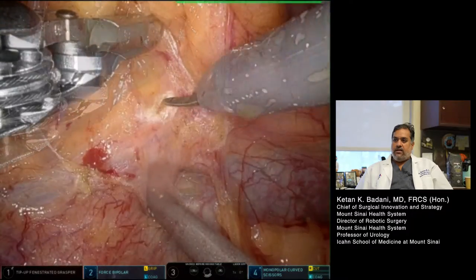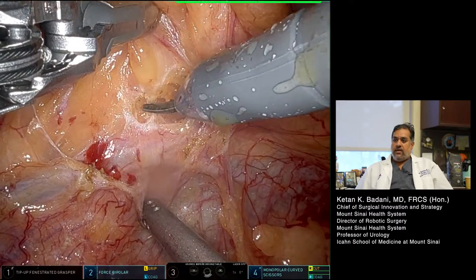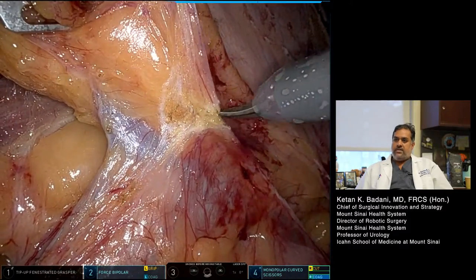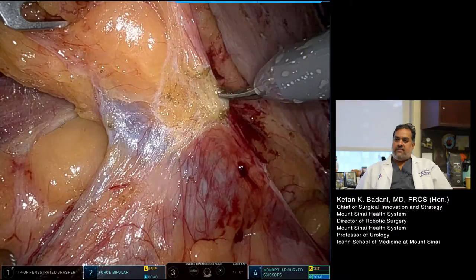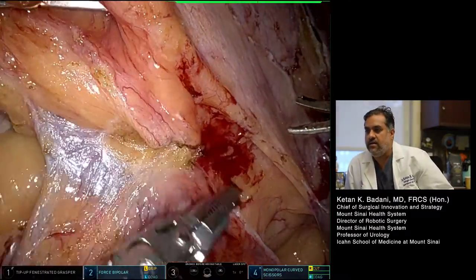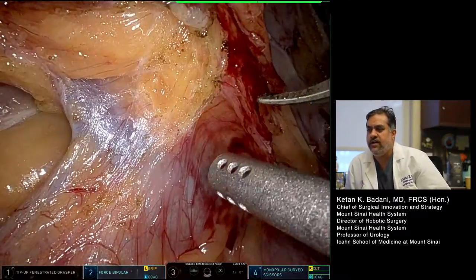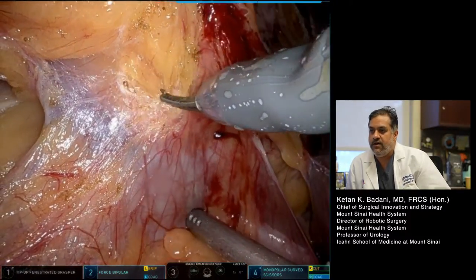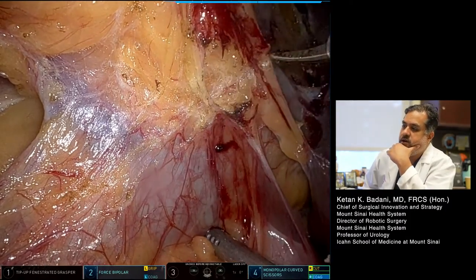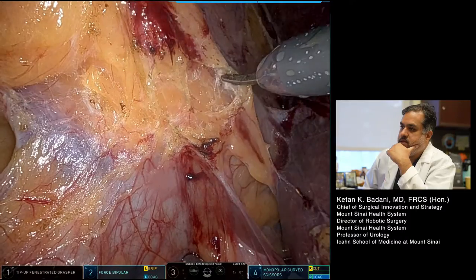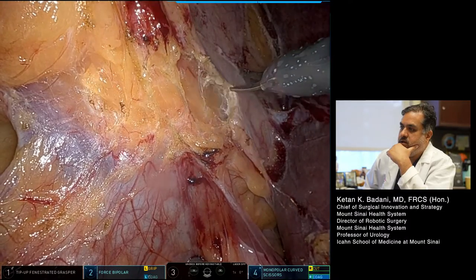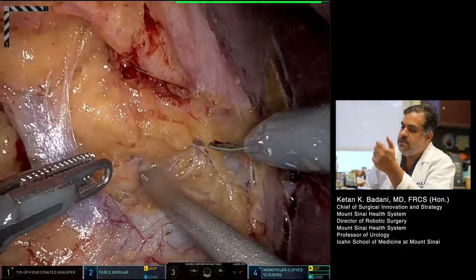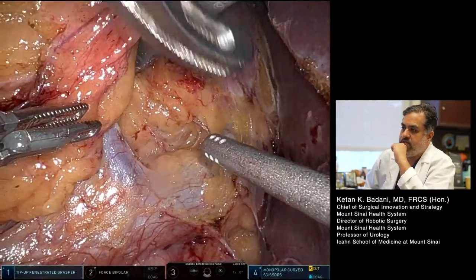Now we have the gonadal vein. The ureter was just seen. On the right side you'll see the anterior surface of the vena cava. I'll incise the retroperitoneum about half a centimeter lateral to the gonadal vein. I almost always preserve the gonadal vein because you don't need to sacrifice it in most cases. You follow the gonadal vein up to the renal vein, as you see here. The duodenum is already mobilized — probably from the prior surgery — so I didn't have to really release it, though typically you do release the duodenum off the anterior surface of the vena cava.